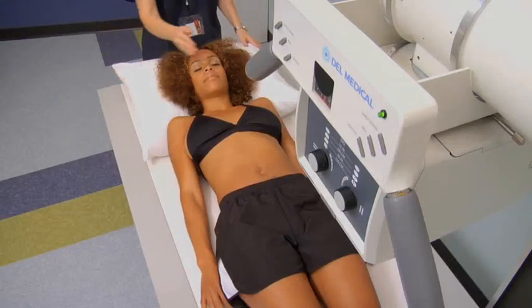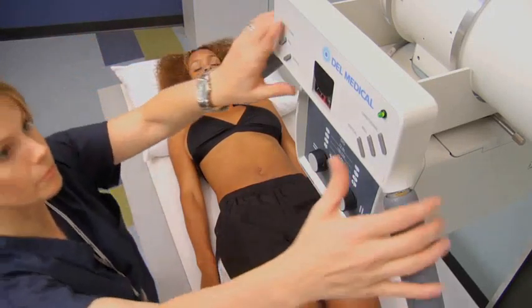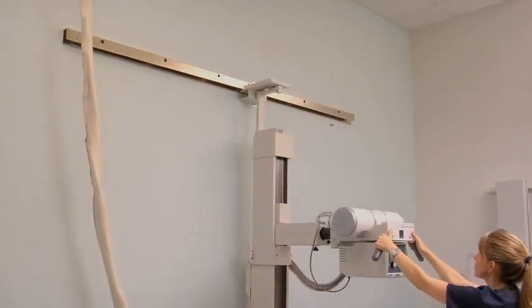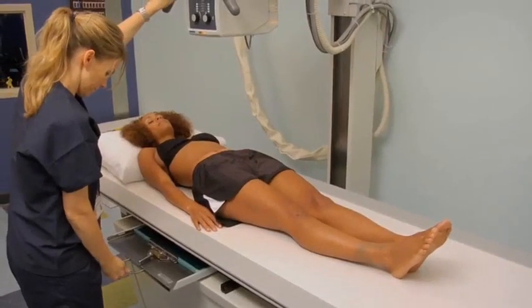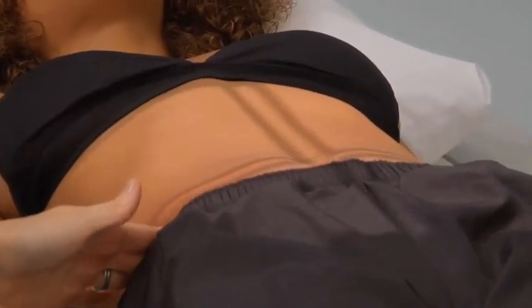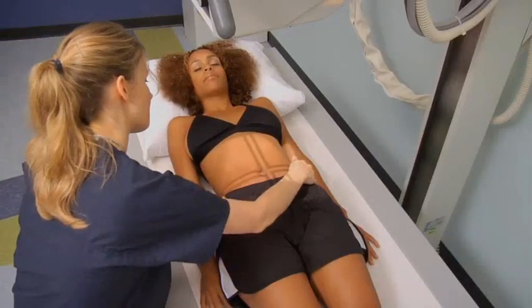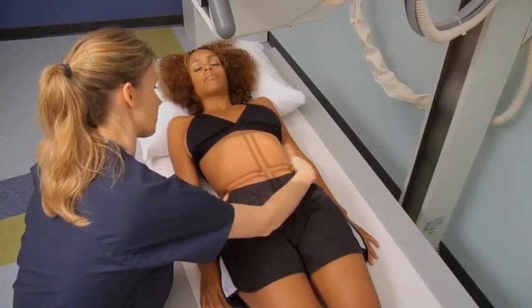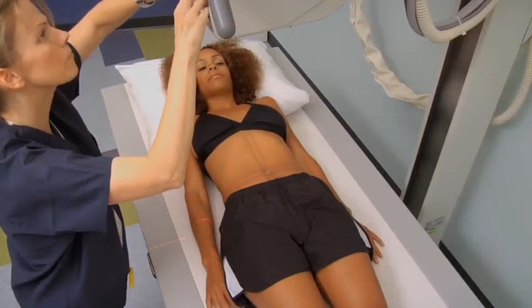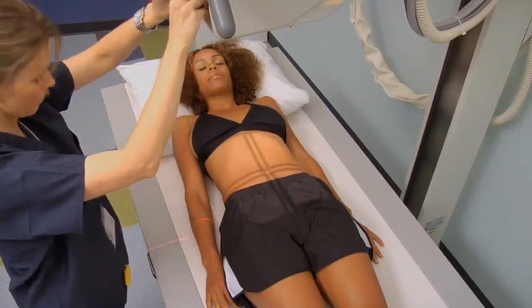Ask the patient to lie on their back on the radiographic table with their head on the pillow. Once the patient is supine, move the x-ray tube longitudinally and center it to the image receptor. Align the central ray to the midline of the abdomen at the top of the iliac crests by moving the table top. Palpate the front of the superior iliac spines to check for rotation. Collimate all four sides to include the diaphragm, lower ribs, symphysis pubis, and lateral soft tissue borders of the abdomen.